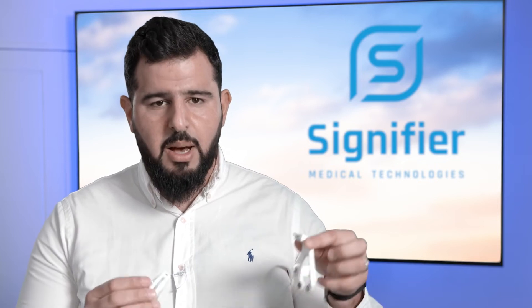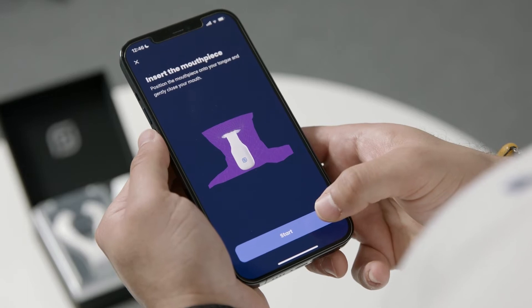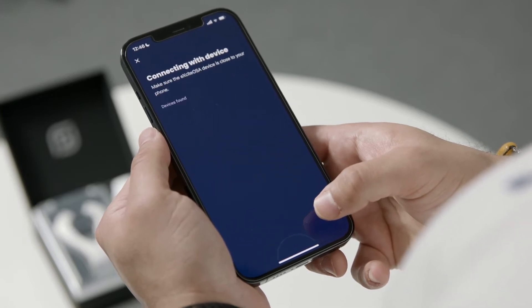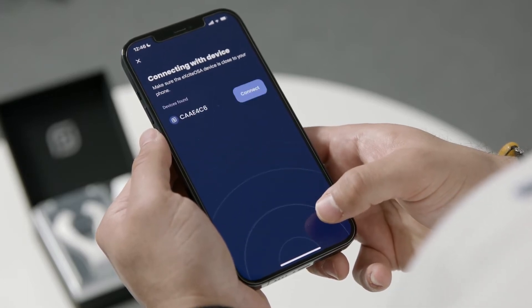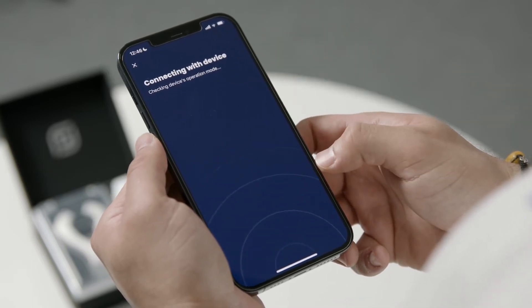If you connect your mouthpiece to your control unit, you will see a flashing S logo. On the connecting with device screen, you will see a Bluetooth ID that is specific to your device. Press connect and you'll see a countdown.